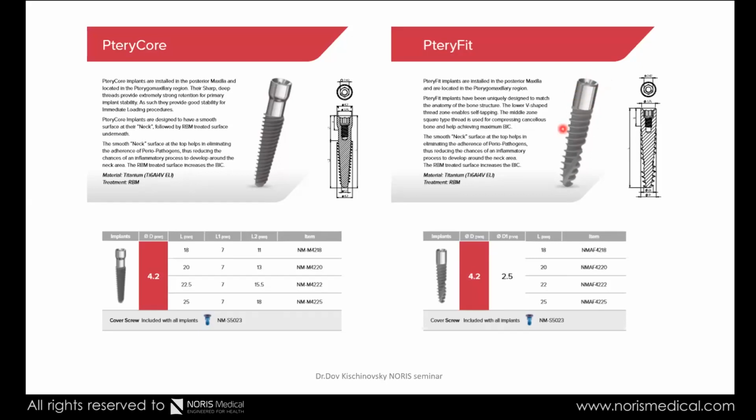So we have this type of implant for pterygoids, and just to understand the drilling protocol for the pterygoid implant, I did not prepare it here, but actually the last drill that we're using would be 2.8 millimeters. And when we take this implant to a 2.8 millimeters, it just goes in and we have very, very strong torque.